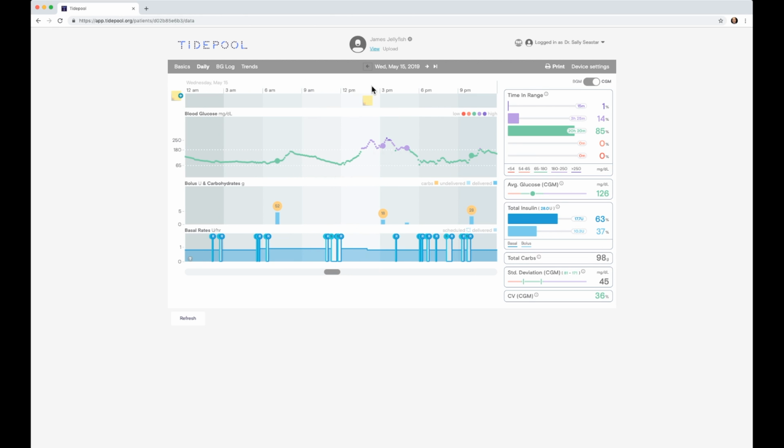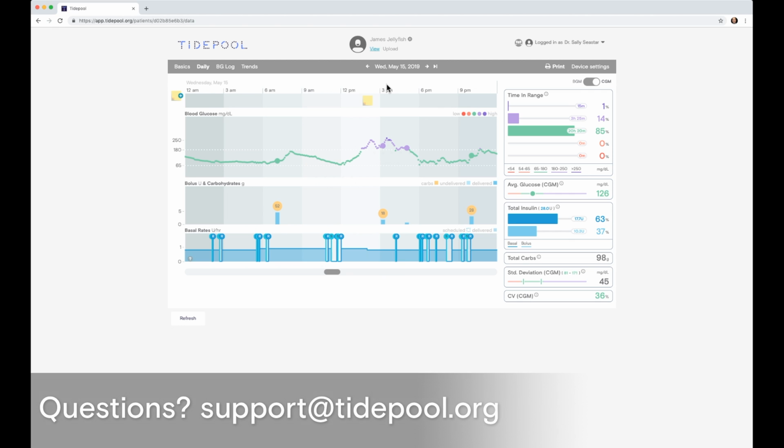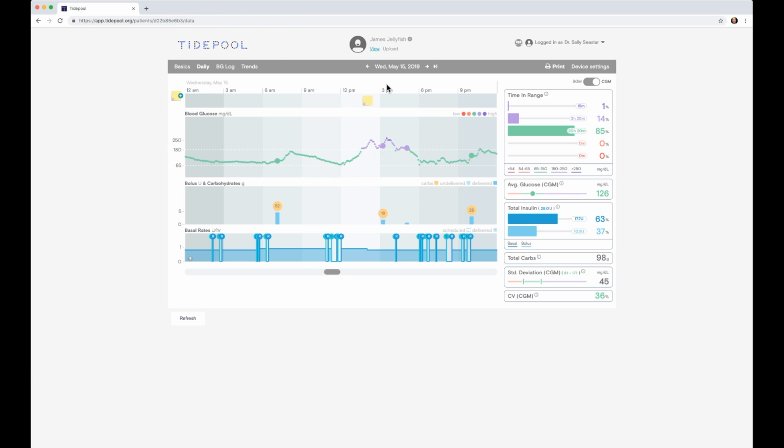Lastly, we have our notes section at the top. Notes can be made within Tidepool Web, either from the patient or clinician side of things, or using our mobile app, Tidepool Mobile, which is available on iOS and Android. Notes can be used to add context to your patient's diabetes data. In the case of James Jellyfish, he could document everything he ate for breakfast over the course of a 2-week period and then go back and review precisely what he ate in relation to the rest of his diabetes data to have a better sense of what his actions were doing to impact his blood glucose numbers.